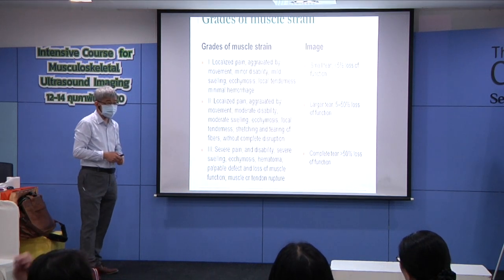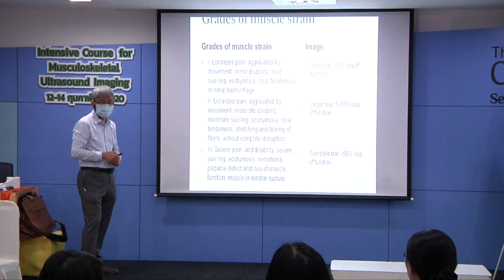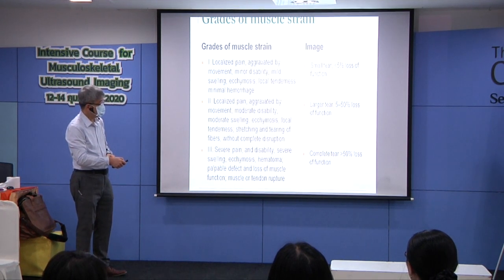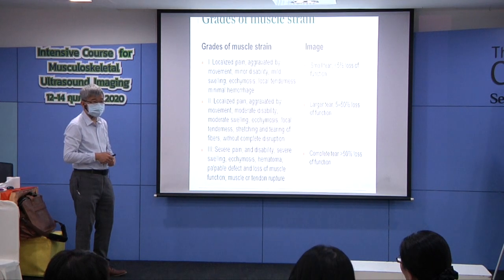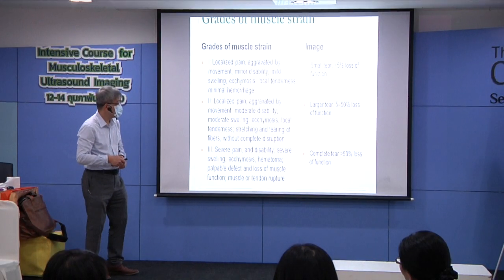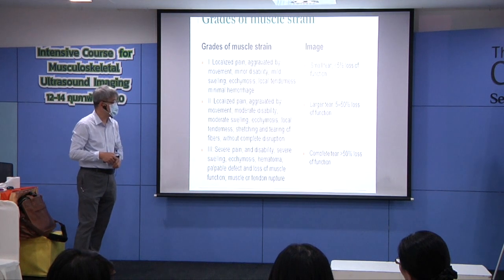If we are talking about mild, moderate, and severe, it's basically by the function. But if we are talking about the findings from the imaging, we will talk about the change in the cross-sectional area. For example, a golf player walked down from the green hill, had a slipping movement, and he feels okay, but something is wrong in the leg. You use ultrasound to check, oh, it's a minor tear. The minor tear size is less than 5% of the cross-sectional area, or 5% loss of function.